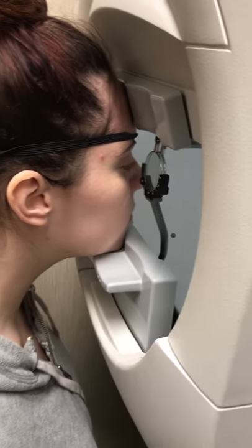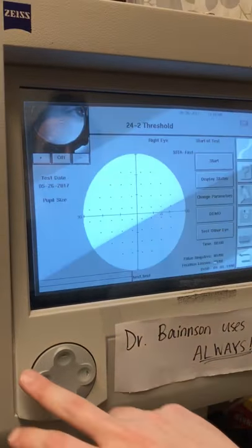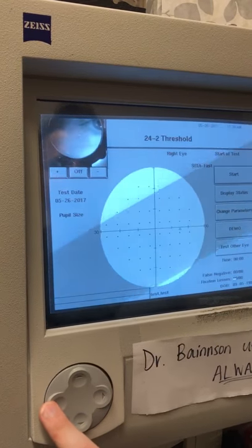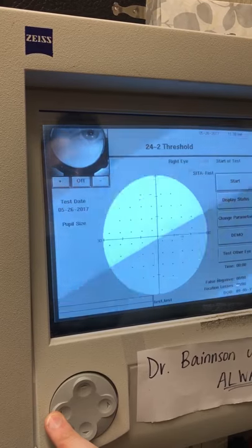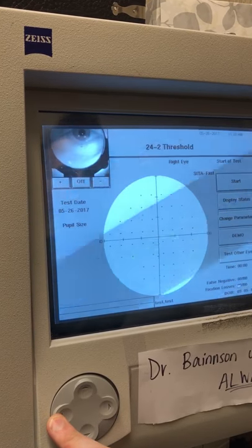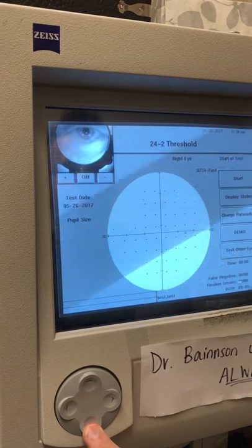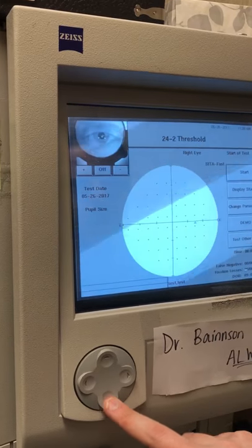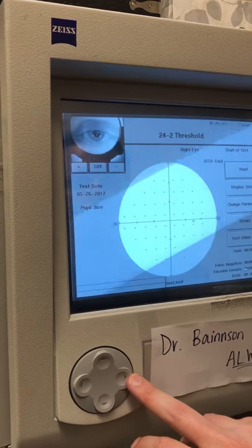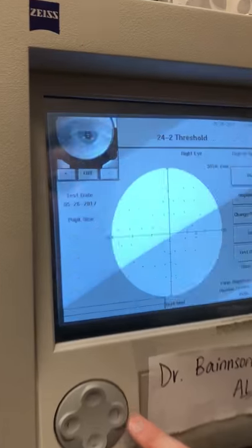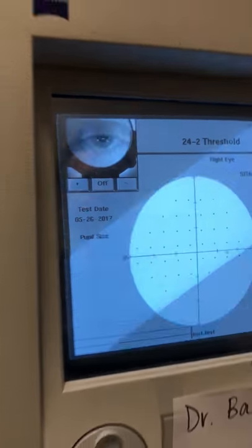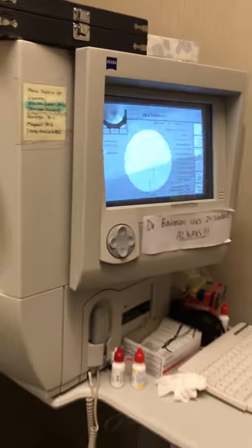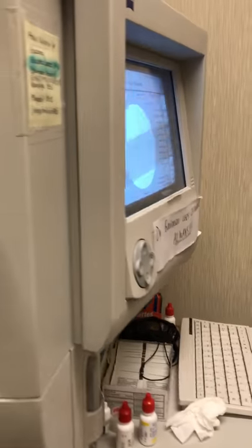Now on our screen, we're going to line her up. Right now she's not lined up, so we'll just move these arrows to get her centered. You want that little cross in the center of her pupil, which it is right now. We're going to close this door and turn the lights off.